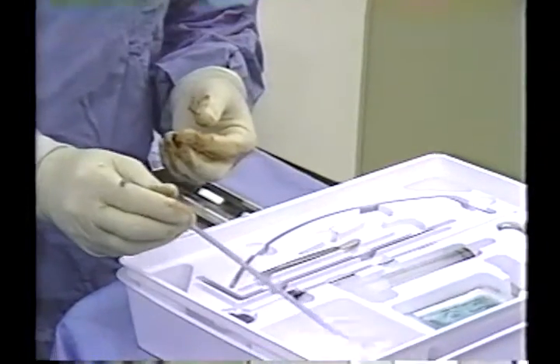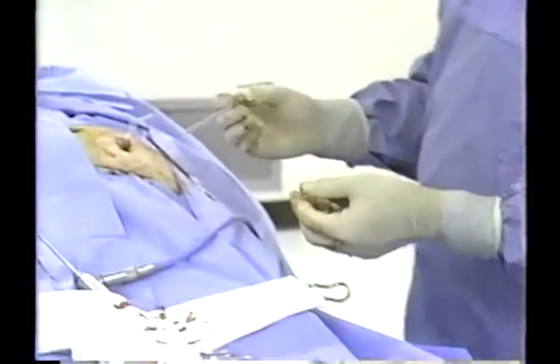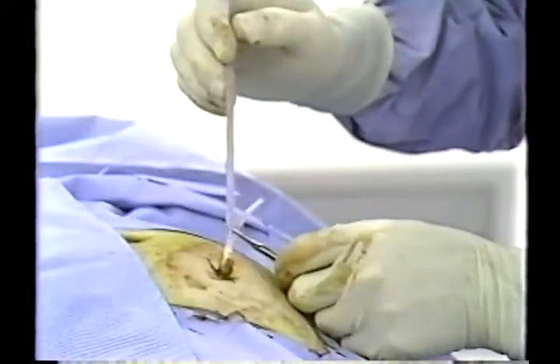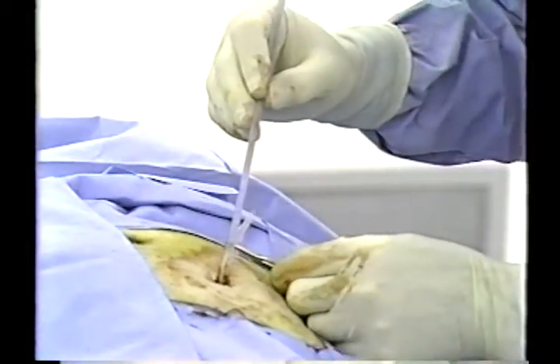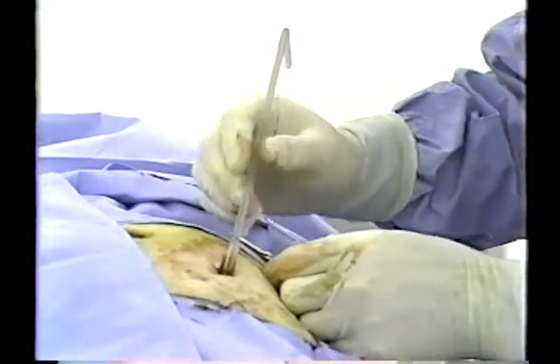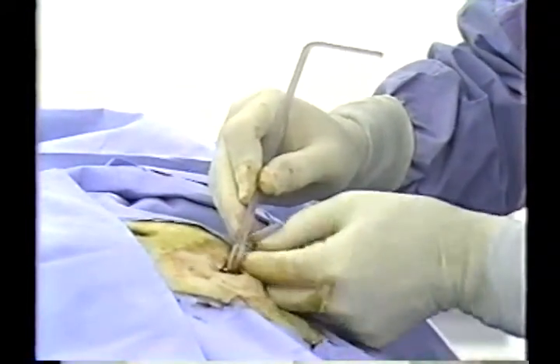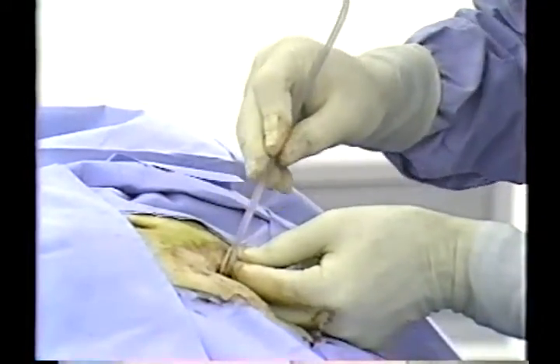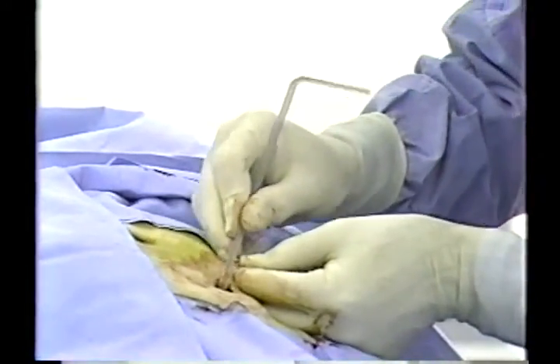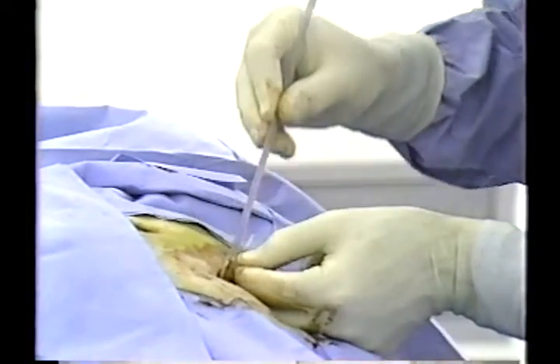Then, insert the 1/4 inch dilator in the same manner, gently increasing the quill catheter guide diameter to accept the catheter. The dilators need not run the entire length of the catheter guide, but merely widen the tract through the abdominal wall. This close fit minimizes post-catheter implant leaks.